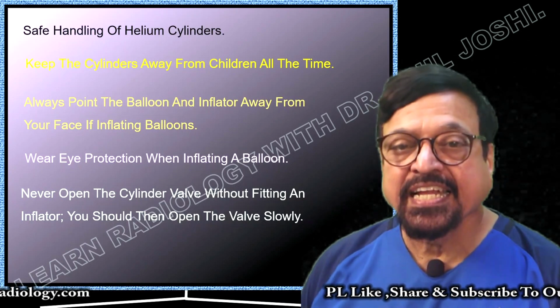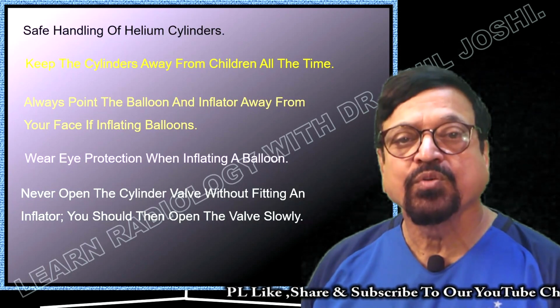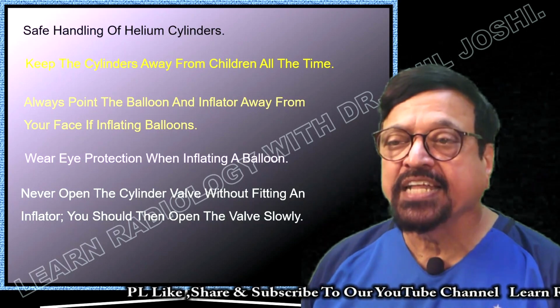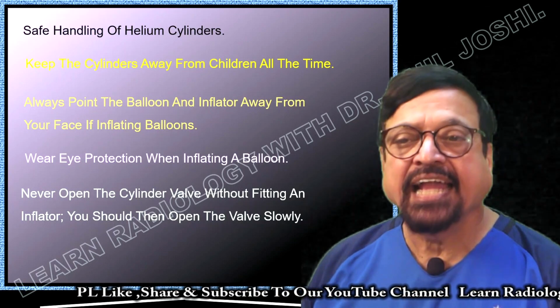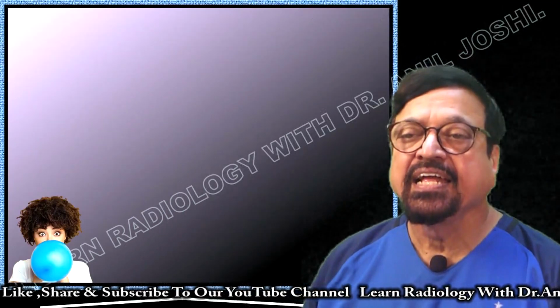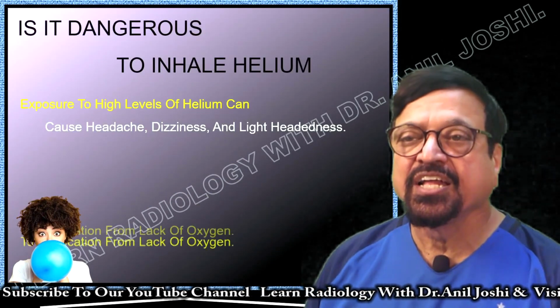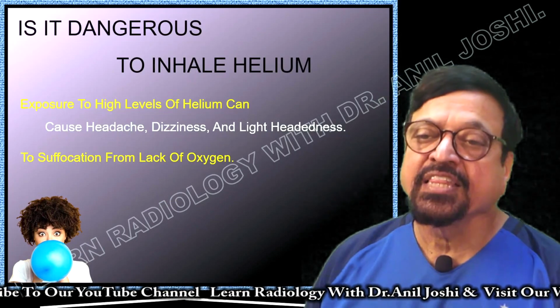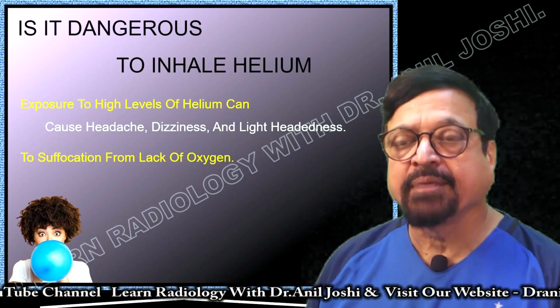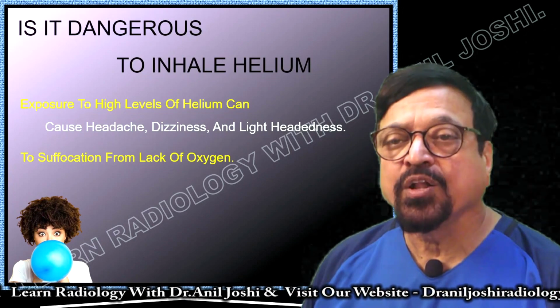However, we are seeing the toxicity effect, and when we see that, we have to see its application in all the fields. So where it is filled in a balloon, they will have to wear goggles. And never open a cylinder valve without fitting an inflator. Otherwise, the helium gas will come out and it will have some disadvantages or side effects. Those do not occur unless you are exposed directly to it, and that does not happen with MRI machines. So no need to worry about the MRI workers. There will not be any problem for them.